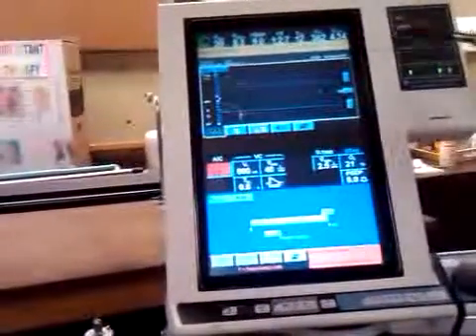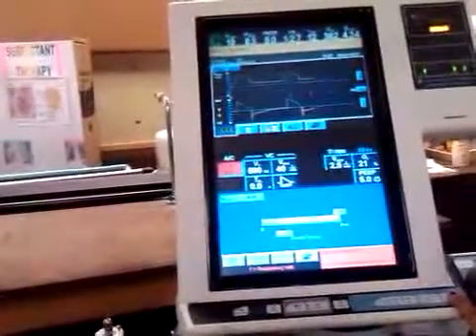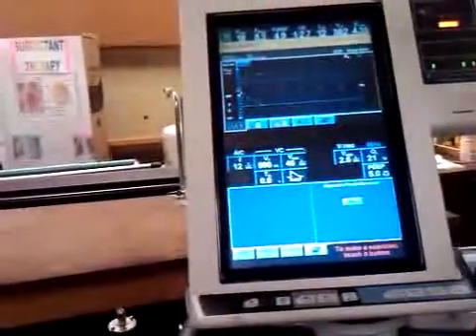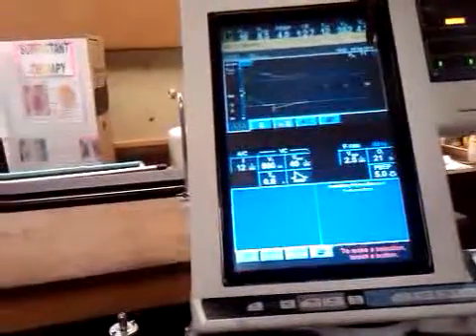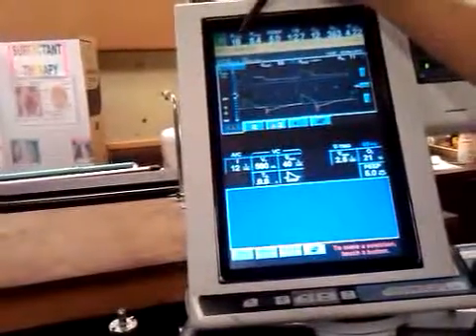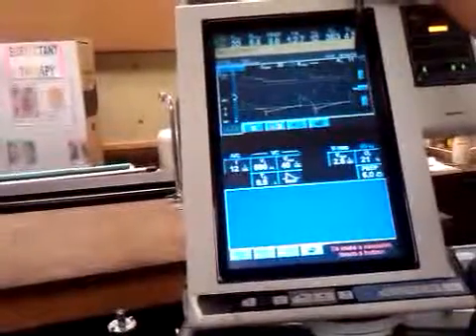After you do that, you want to hit your inspiratory pause located down here. So let's wait. Don't forget that you have a PEEP of 5. So hit your inspiratory pause. Record 19 and 11, P1, P2. Ignore this because you're going to calculate it. So P1 is 19 and your P2 is 11.